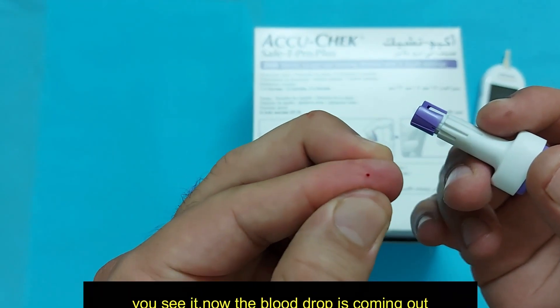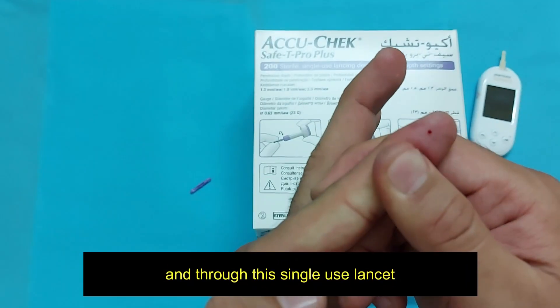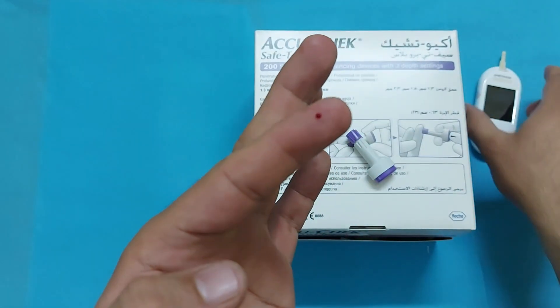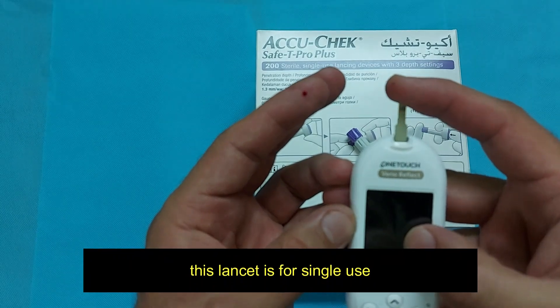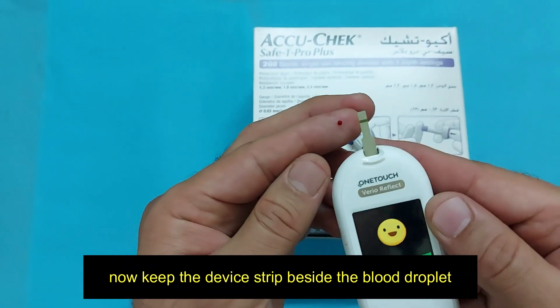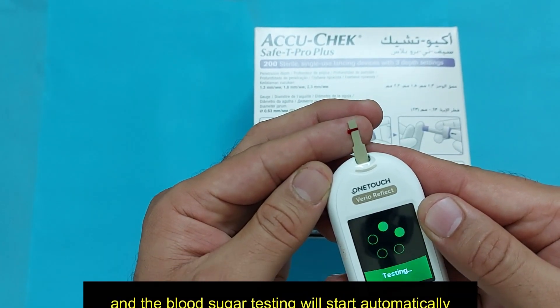Put it on the side of your finger and just click. You can see the blood drop is coming out. This lancet is for single use. Now just keep the device strip beside the blood droplet and the blood sugar testing will start automatically.